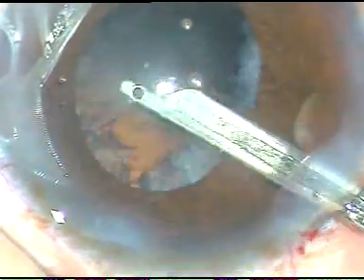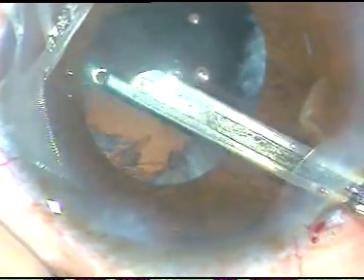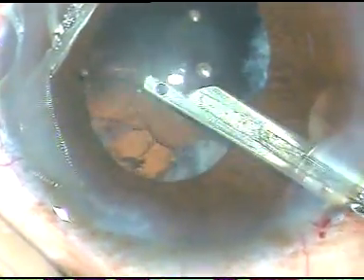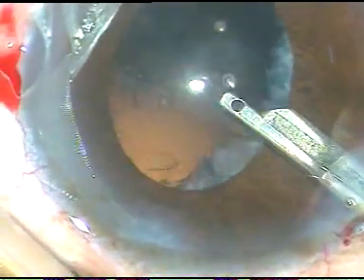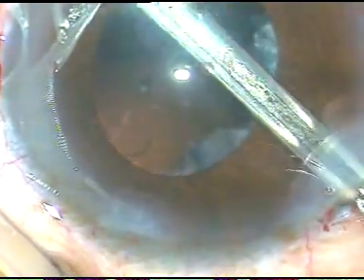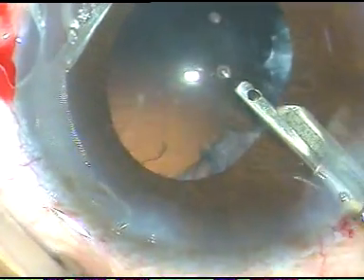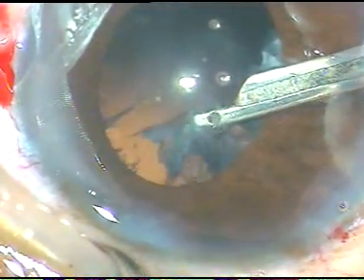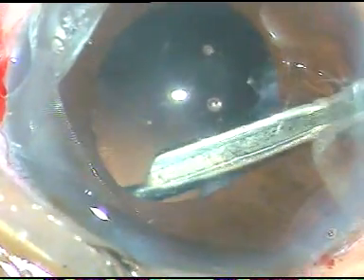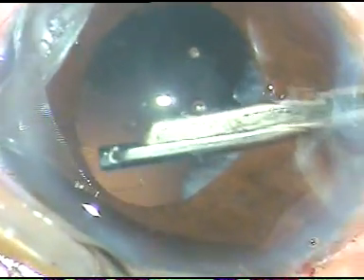Now I am using a Simcoe cannula to remove the cortical matter, going through the main incision and removing the cortical matter from 1 o'clock to 6 o'clock. Now I go through the side port at 8 o'clock and remove the cortical matter which is there at 2 o'clock, 1 o'clock and 2:30 o'clock.